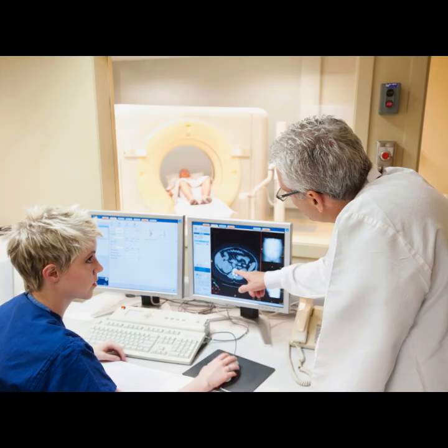When an image artifact appears, and they always do eventually, a technician needs to know exactly what type of decay or asymmetry or undersampling pattern caused it, and they need a standardized procedure to correct it, maybe rotating the sampling pattern or adjusting timing parameters. Your learned path, while potentially efficient, introduces what is effectively an optimization black box right into the encoding mechanism. That makes clinical diagnosis and, more importantly, correction of artifacts infinitely harder.